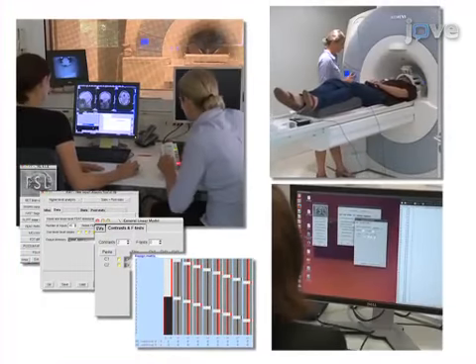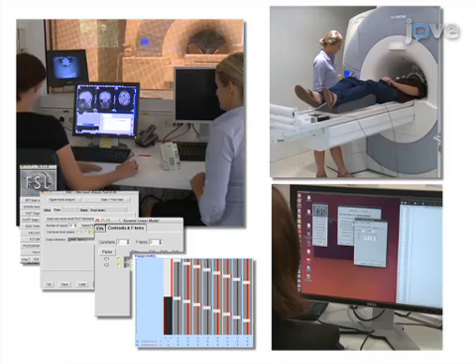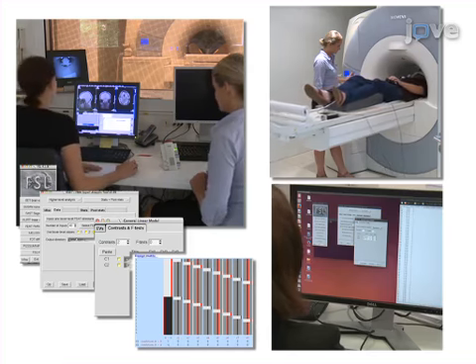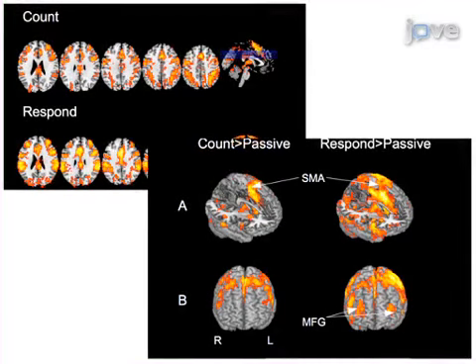Next, the fMRI data is analyzed in order to quantitatively assess the differences in brain activation between task versions. Results are obtained that show how cognitive and motor processes can be differentiated based on appropriate experimental design and data analysis. This method can help answer key questions in the field of cognitive neuroscience, such as identifying the underlying neural substrates of human perception, cognition, and behavior.